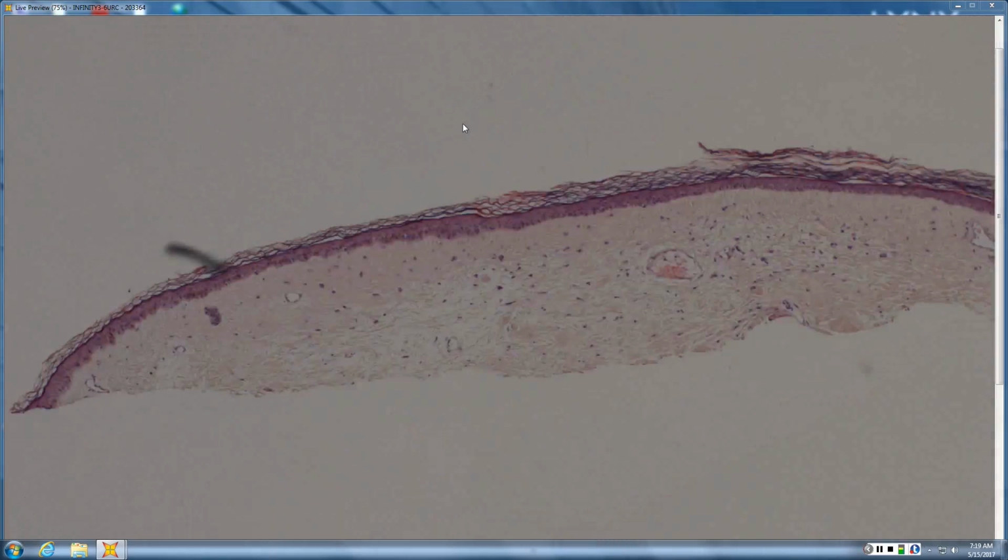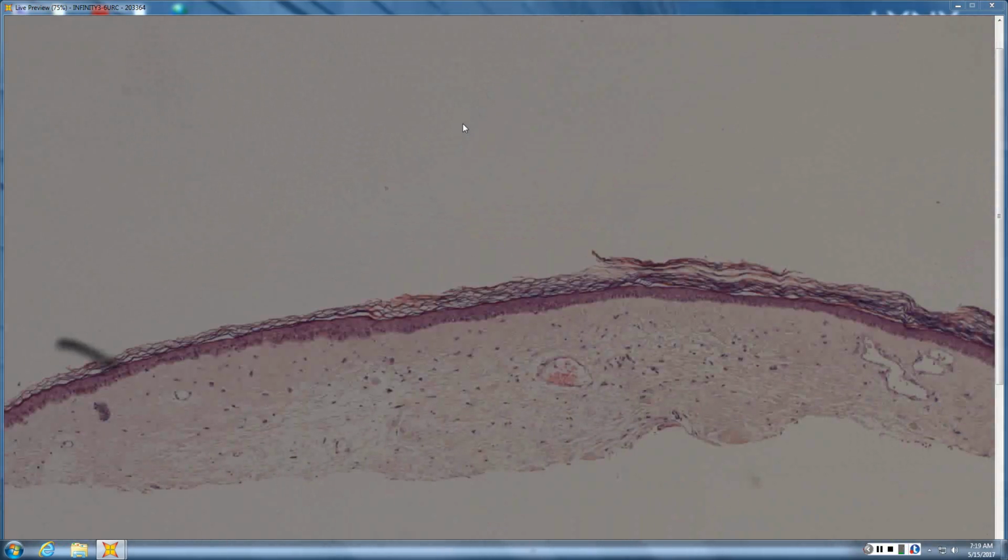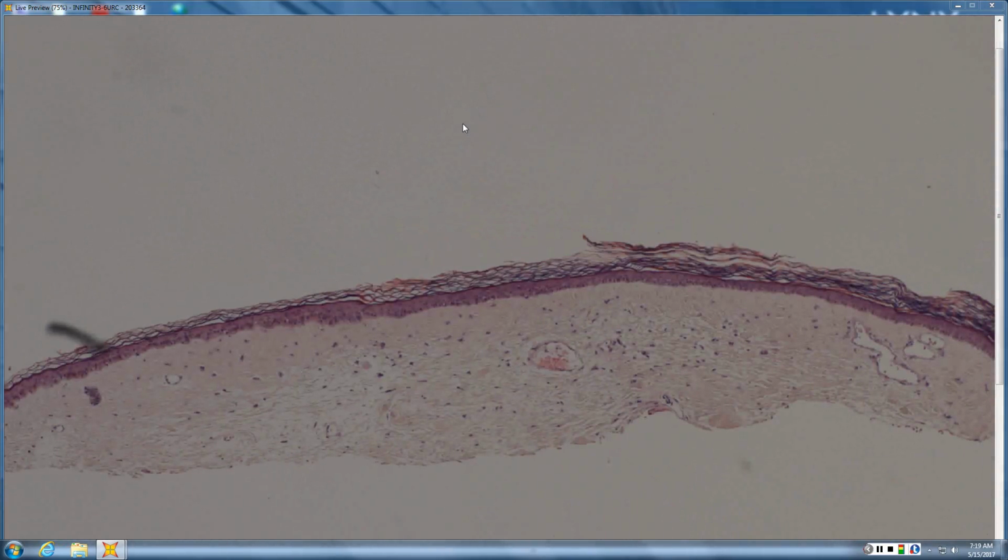Okay, so this is the chronic radiation dermatitis, and this one has pretty much all the classic features. A little bit of hyperkeratosis in the horn. You get certainly effacement and atrophy of the epidermis. There's some vacuolization that's still there, usually, that can make it look even more like connective tissue disease or dermatomyositis or more morphea-form.